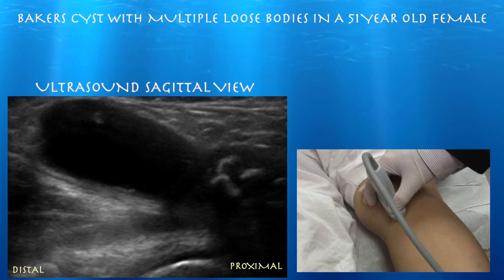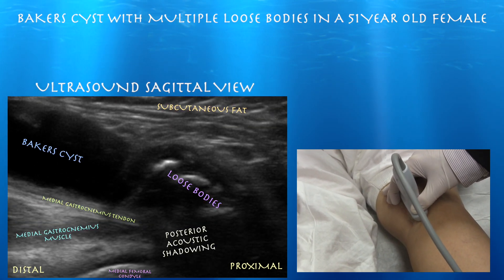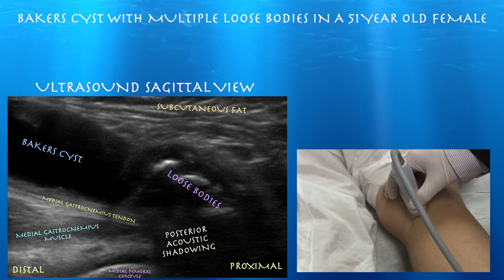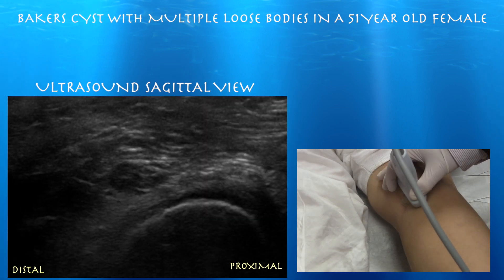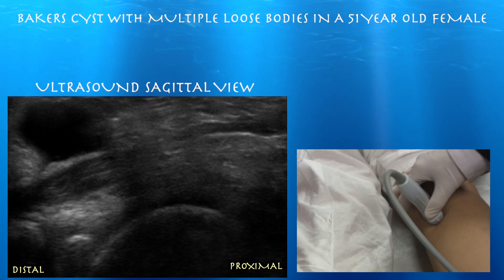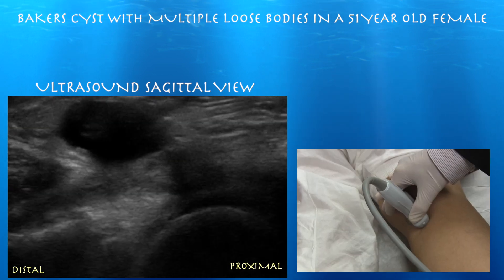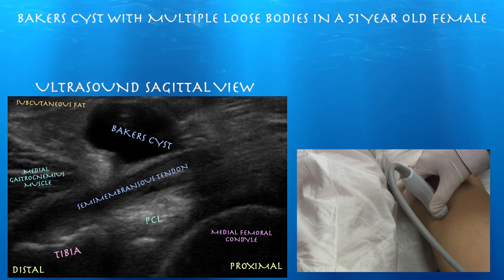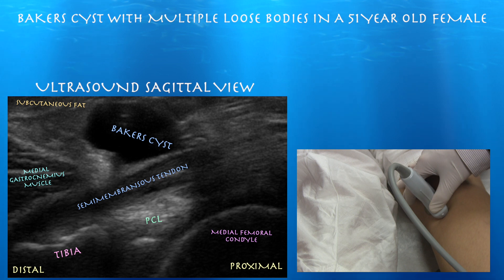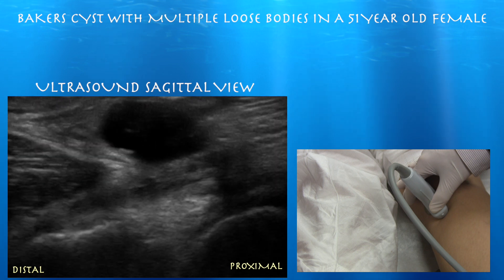Here we're starting medially. We can see a loose body there in the Baker's cyst. Right side of the screen is proximal, left side is distal. You can see that Baker's cyst goes right above the medial gastrocnemius tendon — very medially. We can see the semimembranosus tendon coming down and inserting on the proximal tibia. You could easily mistake the PCL for the semimembranosus tendon.